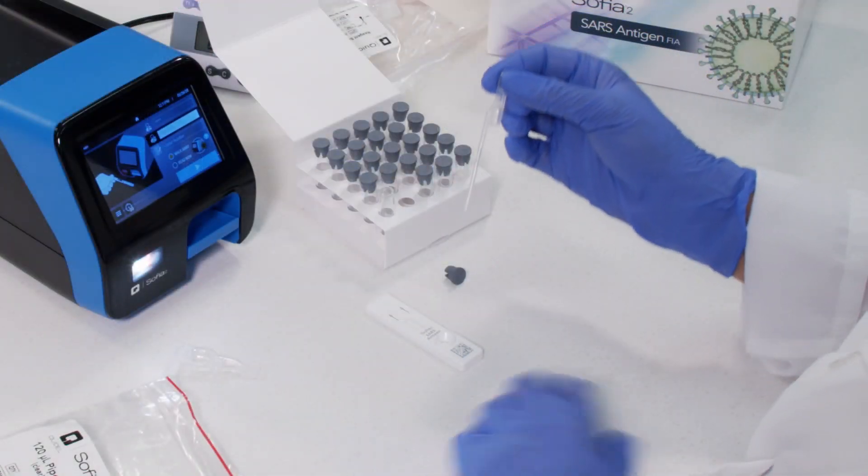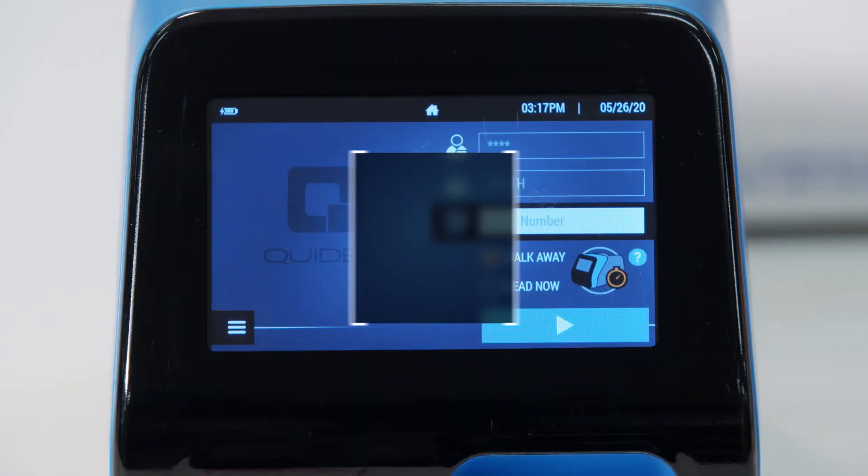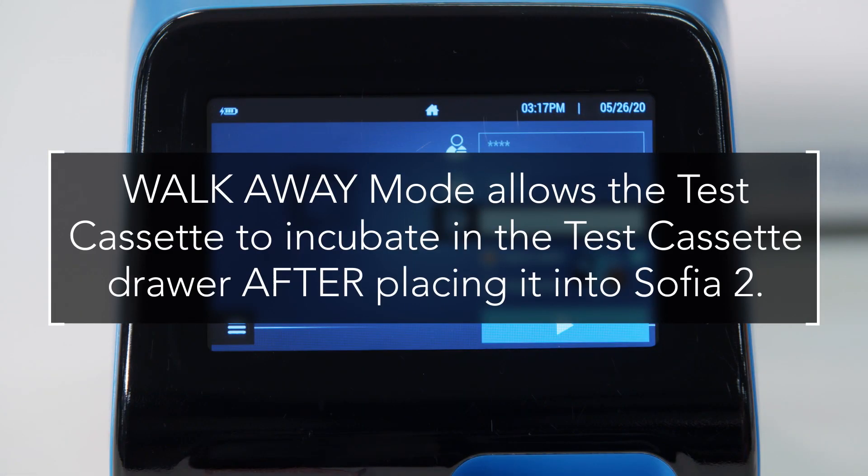Then firmly squeeze the top bulb to empty the contents of the fixed volume pipette into the cassette sample well. In walk-away mode, the test cassette will incubate in the test cassette drawer and SOFIA2 will automatically time the result.